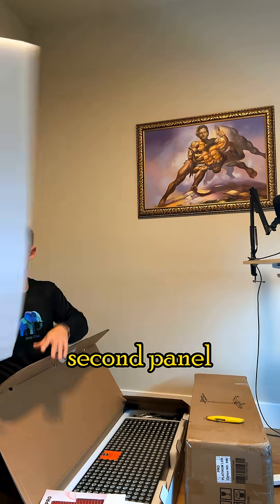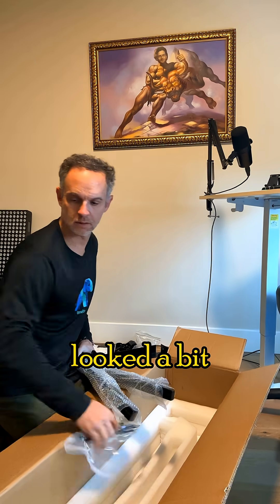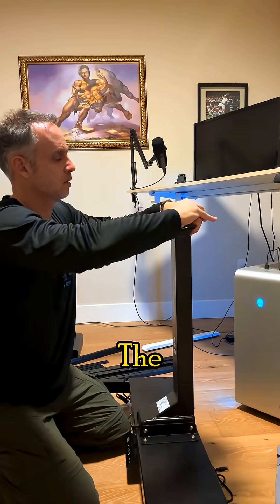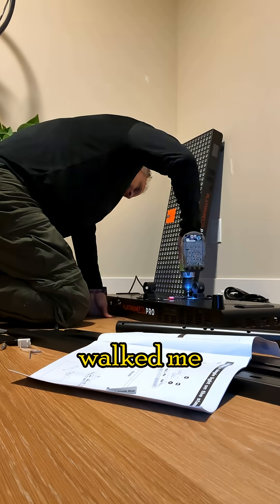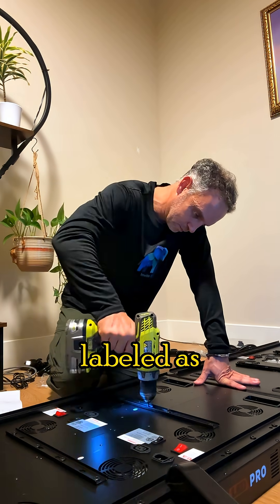I then unpacked the second panel and started to unpack the stand. At first, all the pieces looked a bit intimidating, but it came together a lot faster than I expected. The instruction manual was very clear and walked me through each step of the assembly process, and all the pieces were clearly labeled as well.